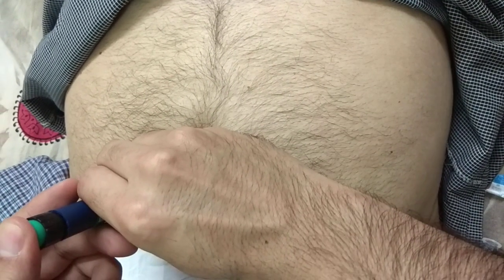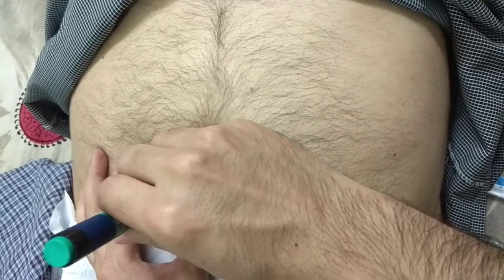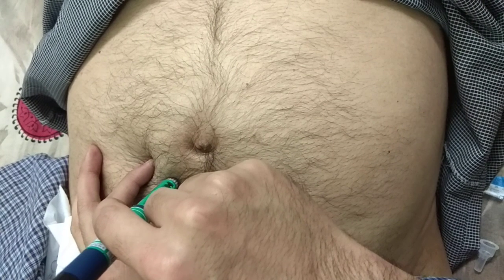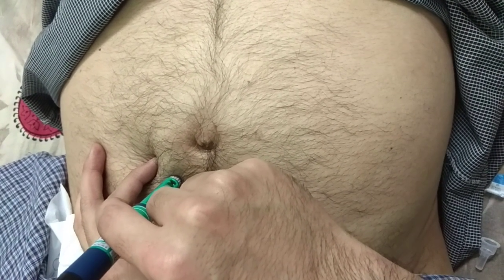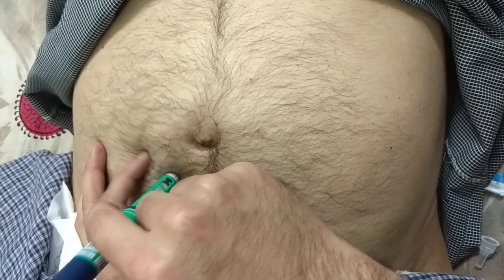Administer the dose. Hold it for 10 seconds and then remove.